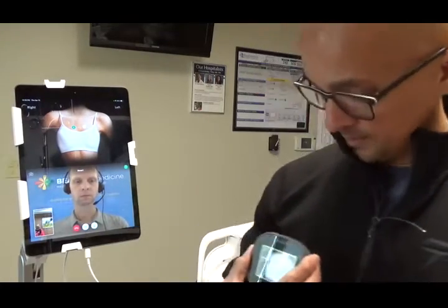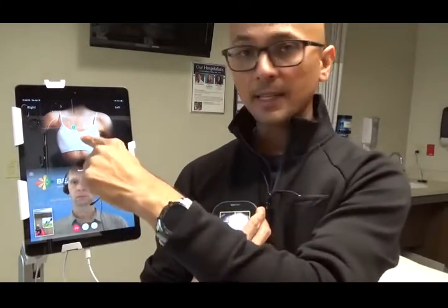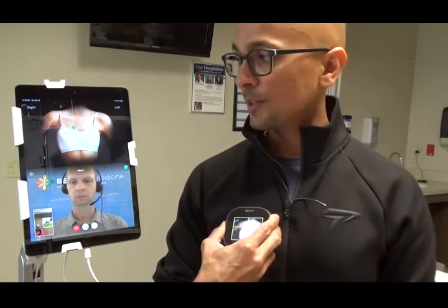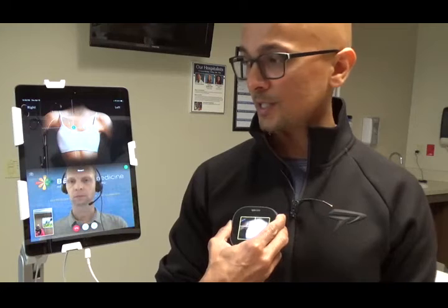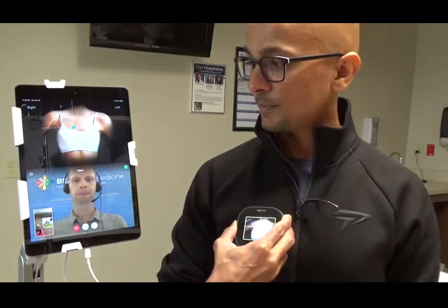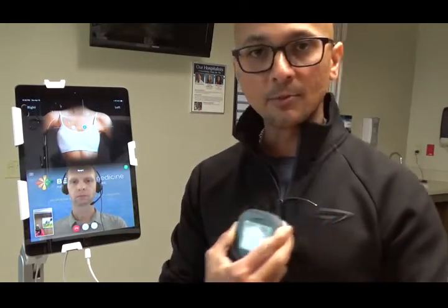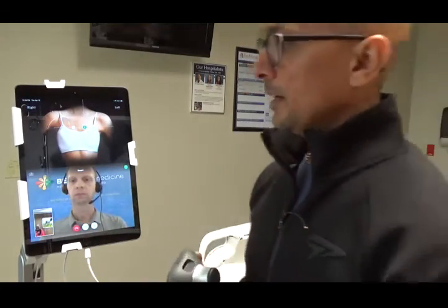So same thing, it tells you like aortic, pulmonic, but in this case, number 1, number 2. So once again, if you have a student or someone who's not from a healthcare setting, but is helping or is just interning, they could still help with these exams. And then we move to the next one. So same thing, we do all 4 over there.